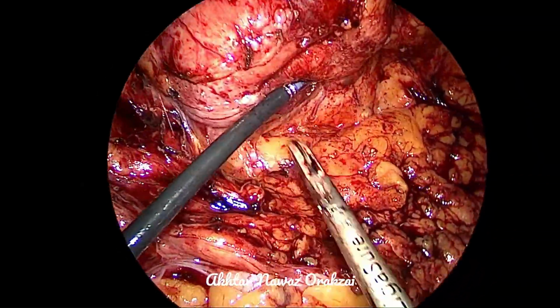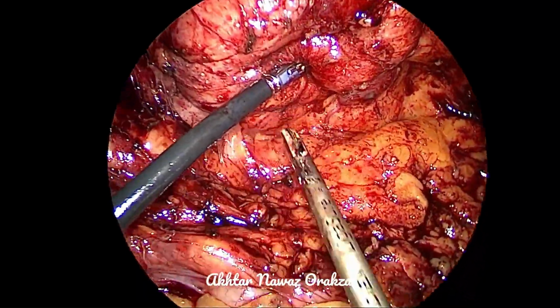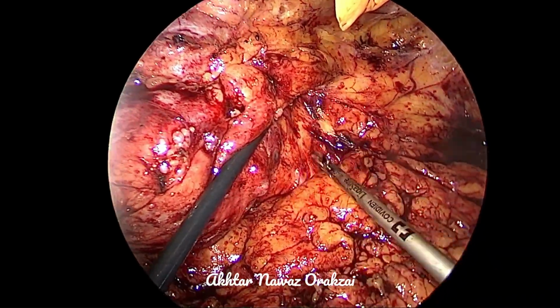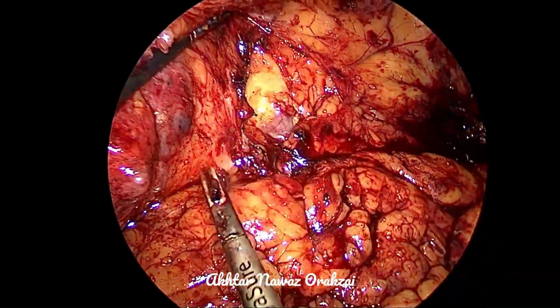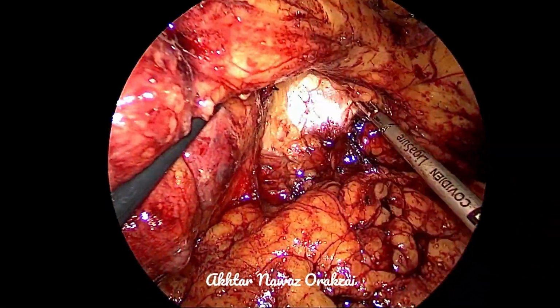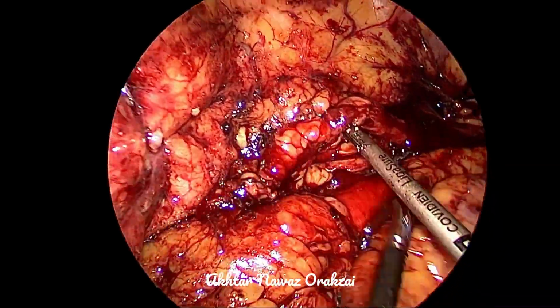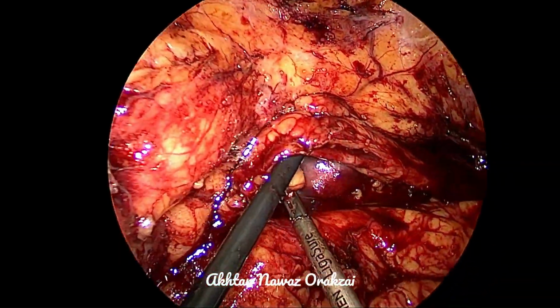And the indication for conversion would be if there is no progress in the dissection for around half an hour, I think it's fair enough to convert the case. Or if you think that there is a highly likely chance of injuring any surrounding structures. We discussed the common iliac artery, the colon, the diaphragm, and the hilum of the spleen.